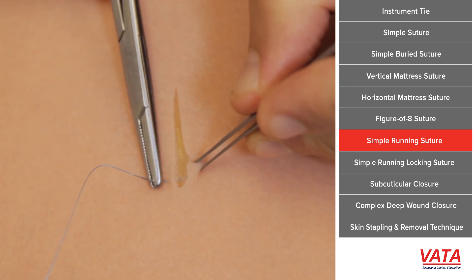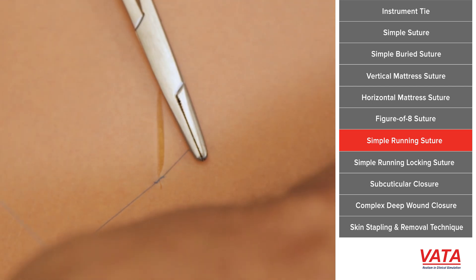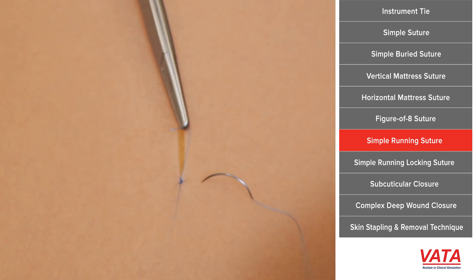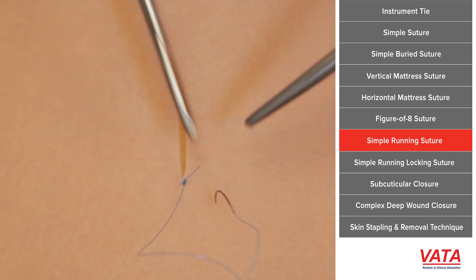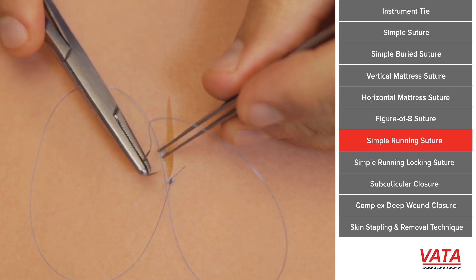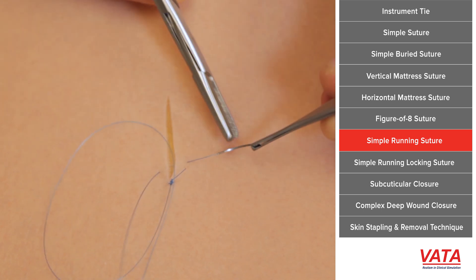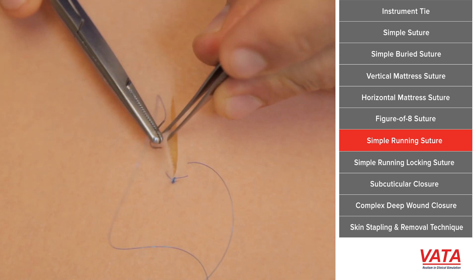So this is just a simple suture. You'll tie your first one with your instrument tie. Keep the length of your suture long enough for the job but not so long that your hands are going all over the place. Now what we're going to do is reload and move along the same distance each time. Even though when we tie the stitch it looks closer to the skin, we need to enter the skin exactly the same place — here it's just a few millimeters on each side.